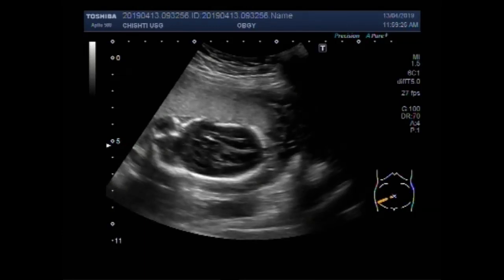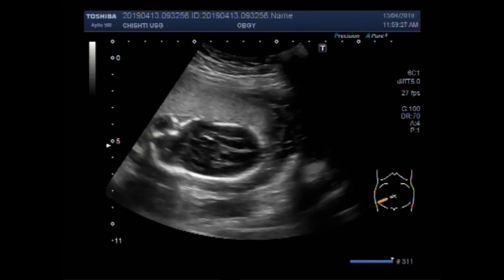The fetal skull bones are overlapping on each other and the fetal skull is more elliptical. This is overlapping of skull bones — positive Spalding sign.